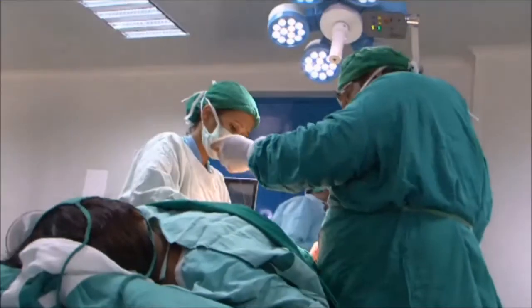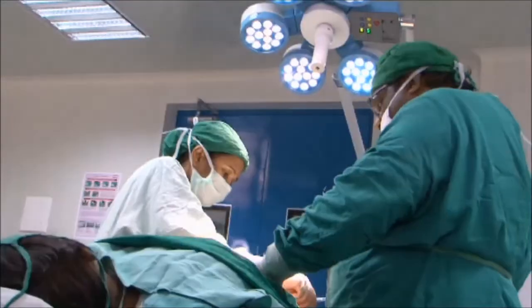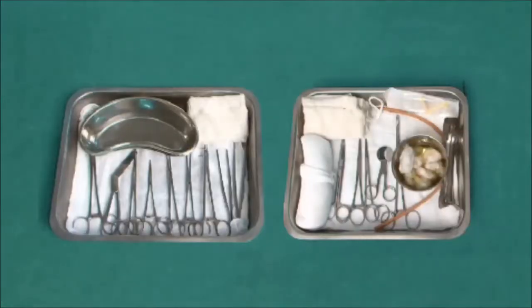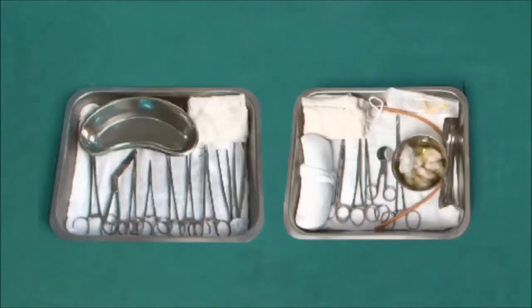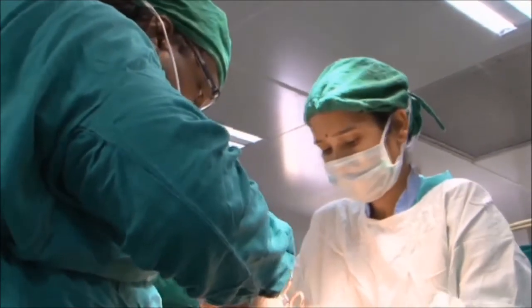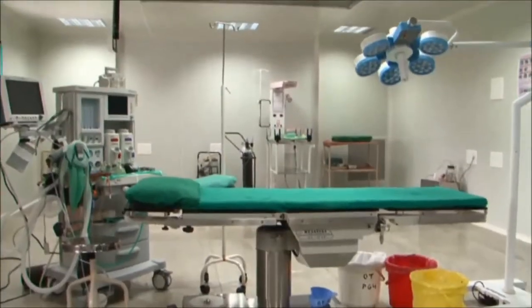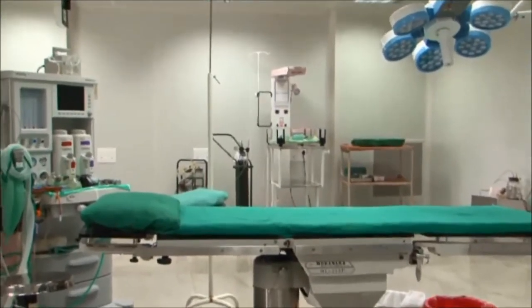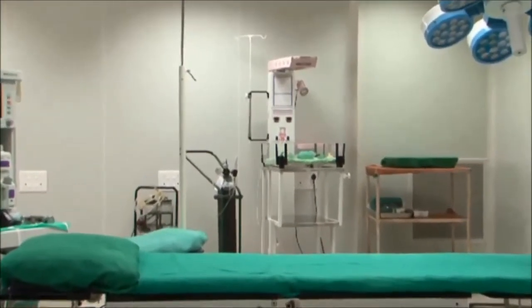The obstetric operation theater should have a separate tray of pre-autoclaved and wrapped instruments in sufficient numbers, so that one set is available for each caesarean section. Maternity operation theaters should also have a newborn care corner with all accessories and equipment.